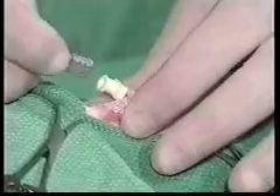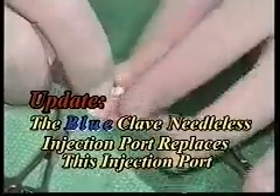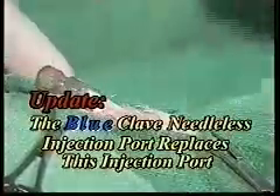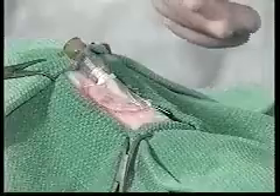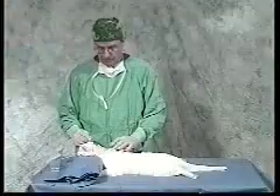Next, we are going to put in the needleless injection port. This is a special port — it is not a regular male adapter; it is specifically designed for the needleless clip locks we are going to be using with this system. We put that on snug. The next step, we are going to go ahead and remove the drapes from this patient and hook up some fluids so that you can see exactly how that all works.